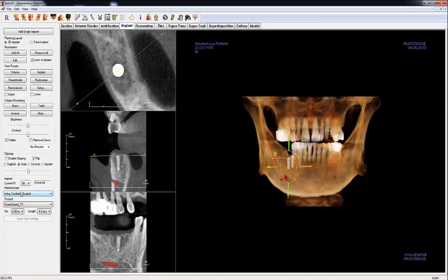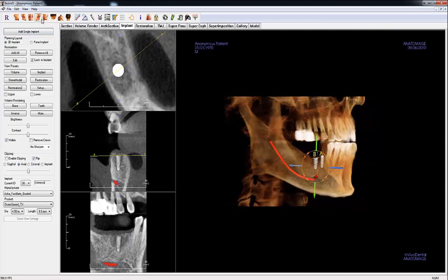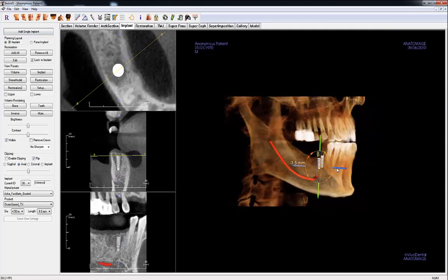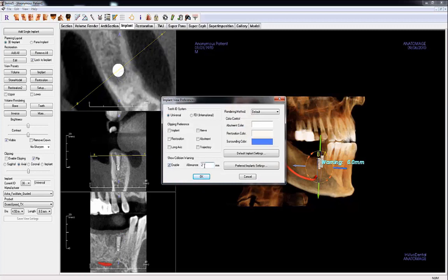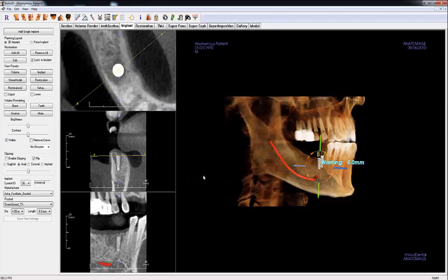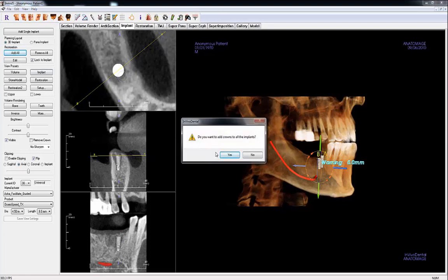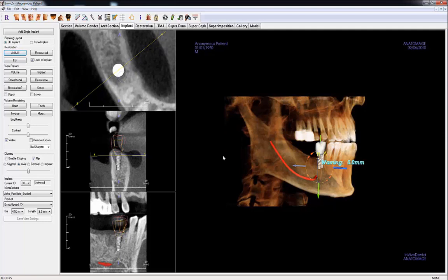There are various features in the Implant tab to assist with implant planning. In vivo will display a warning sign when an implant is positioned too close to another implant or nerve. You can turn off the warning notification and change the allowance for the warning under Preferences. In the Restorations section, you can add restorations to your implants by clicking Add All. You can modify the restorations in the Restoration tab.